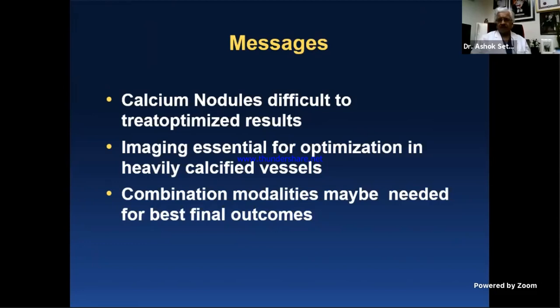and there's a guide wire bias happening all the time. You have to understand where the biases are happening and where it will actually cut or where it may perforate, and it may not even go through. You've got to ease it across bends and curves. That's very important. The moment you feel that it's going to go straighter rather than take the curve, and it won't take the curve, by the way, if you have the disease process very tight prior to the lesion, because that's when it'll come out at an angle. To take a turn, there has to be enough space in the vessel for it to actually bend.